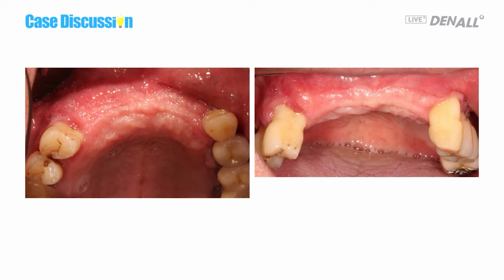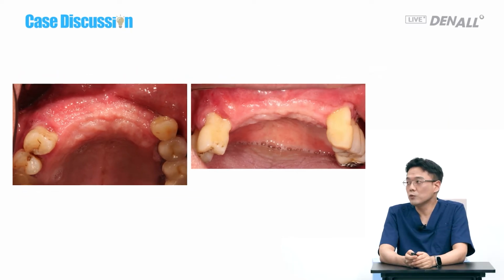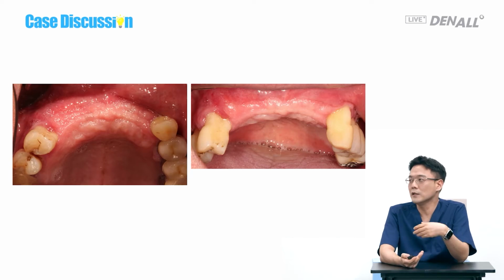Horizontally, actually the arch is contracted inward. So due to lack of bone, I told the patient that it's difficult to place implants. We always need to lower the expectation of a patient, and we are not confident in doing so.